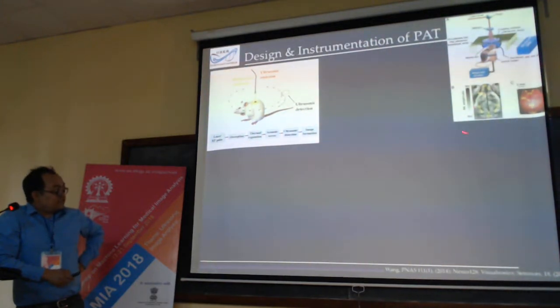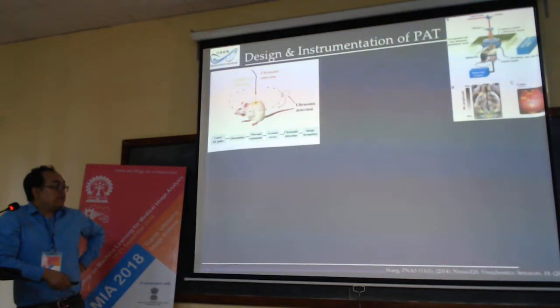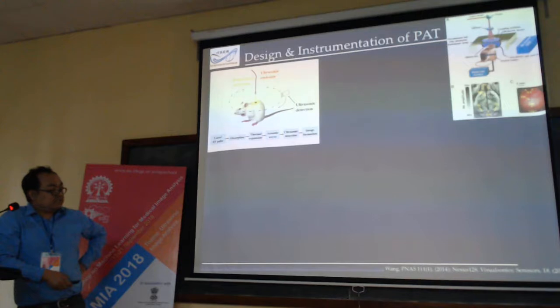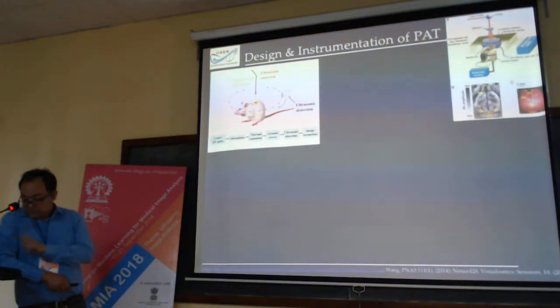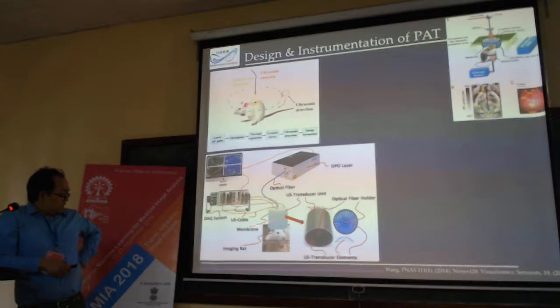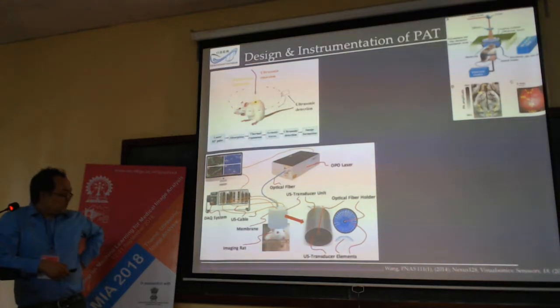To my knowledge, up to this stage of the development of photoacoustic tomography, the resolution is limited to 500 micrometers, and of course the imaging depth is of the order of centimeters. Now people started thinking of how to improve the resolution. That is what people started thinking of. So this is the kind of imaging system that we are developing now.